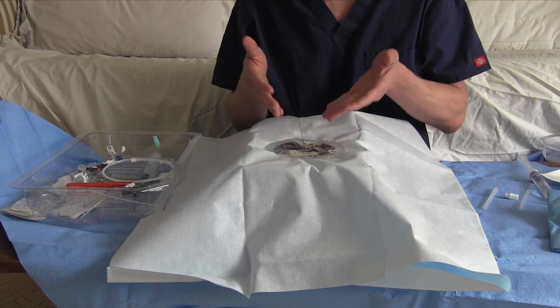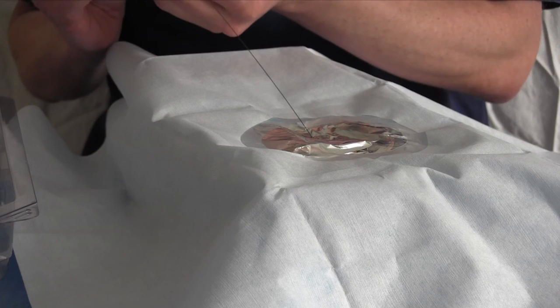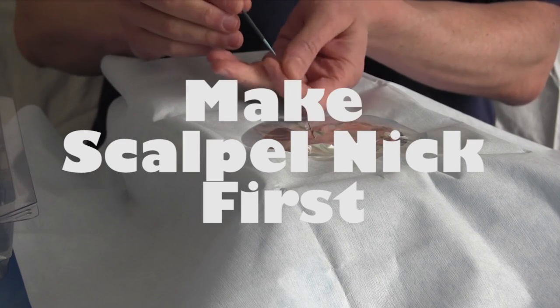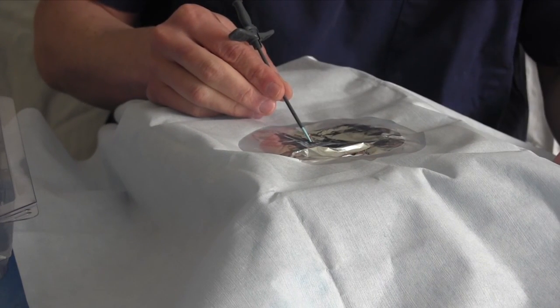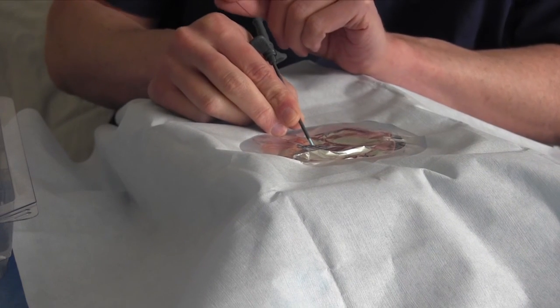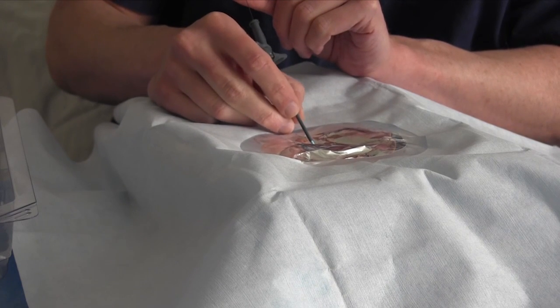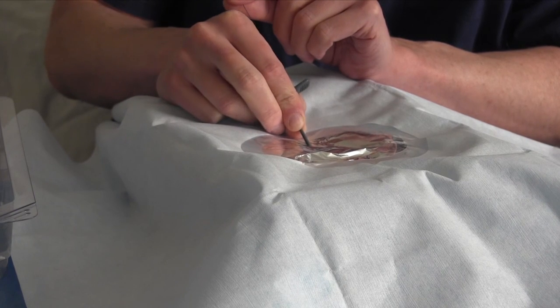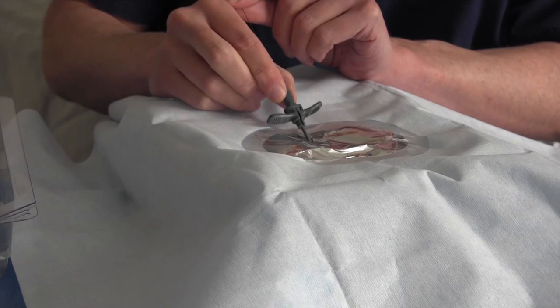But now you have a vessel with a wire in it. The tourniquet is off. And what you're going to do now is put the dilator on the wire, advance it to the skin, making sure it pops out of the back. And now when this blue portion is actually at the skin, you want to really grip it close to the skin itself. Hold the wire with your non-dominant hand, and a centimeter or two away from the skin, gently advance, regrip, advance, regrip, advance. And you want to be parallel to the vessel itself, so you're not back-walling it, until you're all the way at the skin.